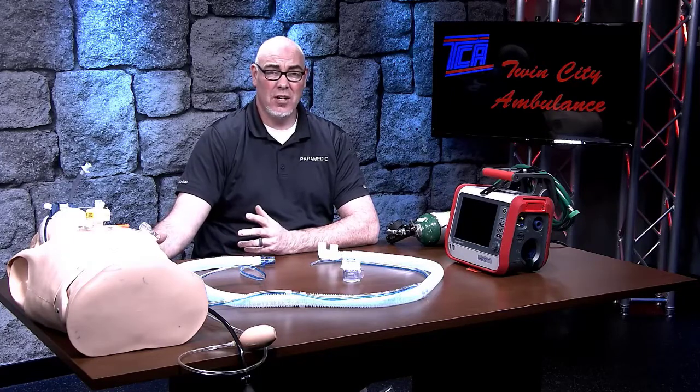Hello everybody, thank you for tuning in to this training video. This is Sean Haltzman, paramedic and education guy, and today we're going to be going over the basic introduction to the new Hamilton vents, which we'll be putting out into the field very shortly.